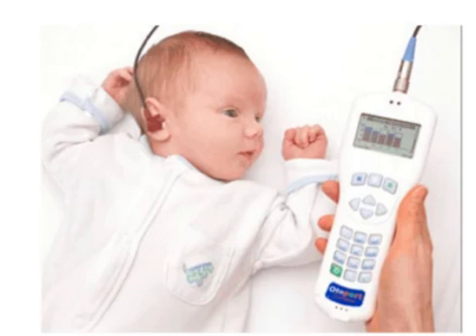The all-or-nothing response from OAE makes OAE an excellent screening test for hearing loss. The Universal Newborn Hearing Screening Program, UNHS, has widely been adopted throughout North America, Europe, and most developed countries. UNHS incorporates a combination of OAE and auditory brainstem response, ABR, testing.